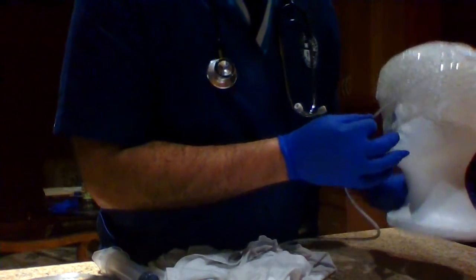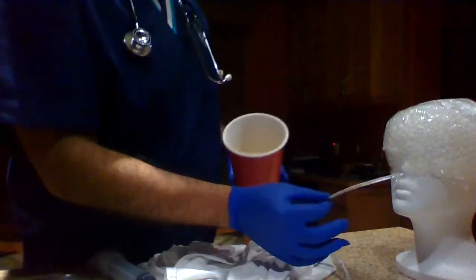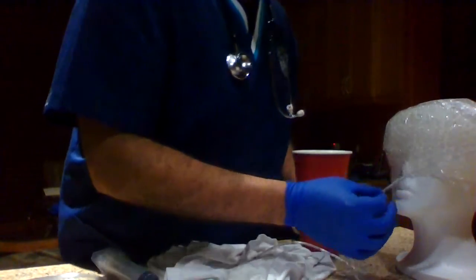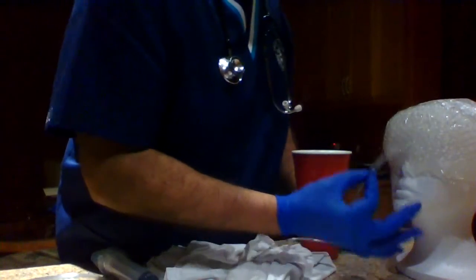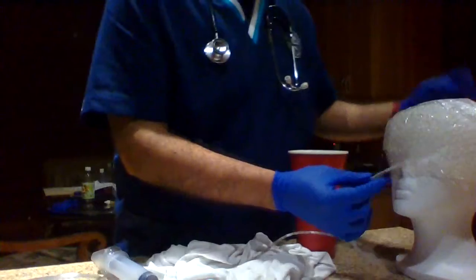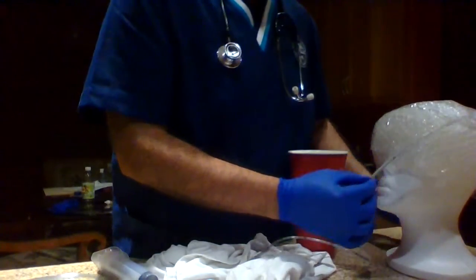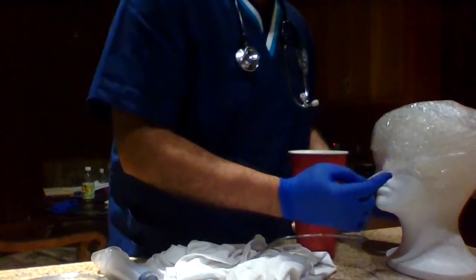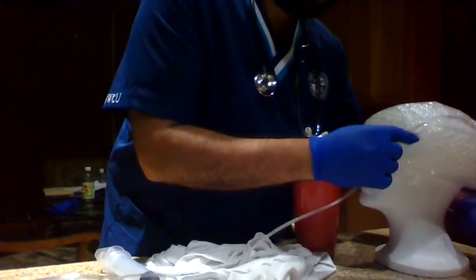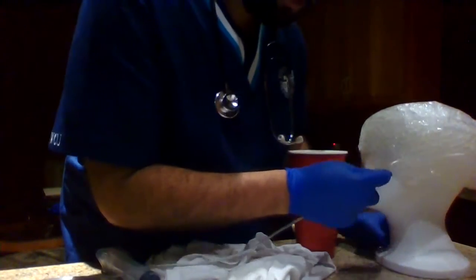And right here you have a good spot. So this is when you grab your water and you have a straw. Basically every time you ask them to swallow, you are going to advance this tube. I've actually done this before, and what I do is have them swallow, and I say swallow, swallow, and each time they're swallowing, I just advance the tube, advance the tube. So now we have the tube where we want it.